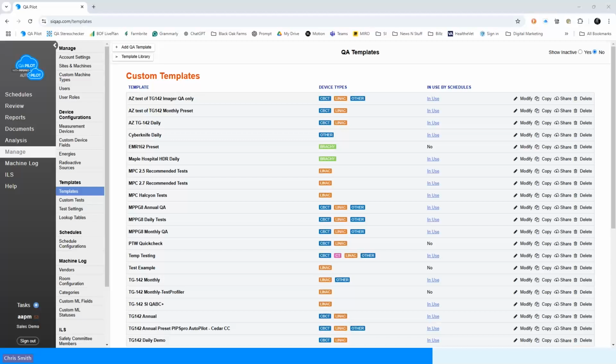So they do work together that way, including asymmetric fields, FC2 phantoms, MLC tests. That can all be done in our QA pilot product, again, because it's so customizable. It has the APIs built in and ready to get that information. PIPS Pro doesn't have all of those pieces built in. So those two working together make a ton of sense.